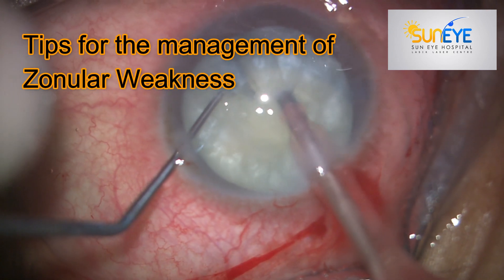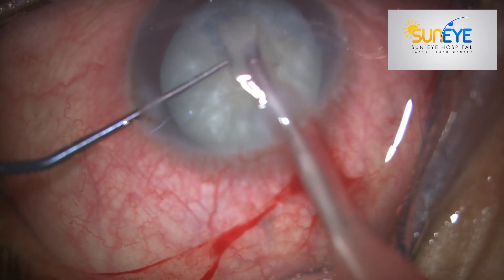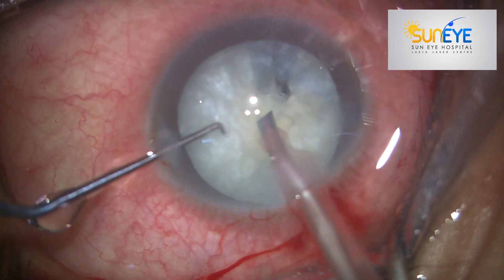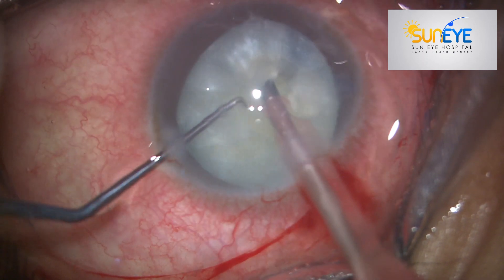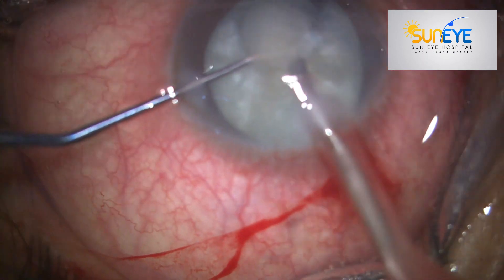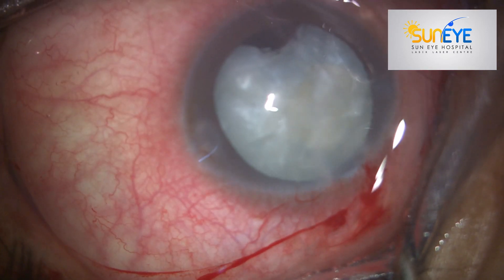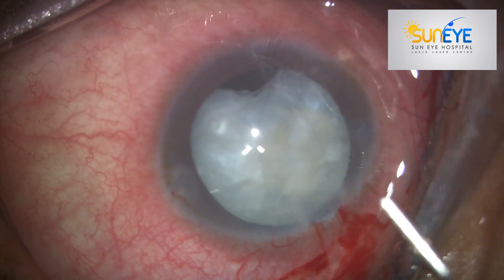Hello everyone, today I'll be showing a video on tips for the management of zonular weakness. This was an intumescent cataract and I started the nucleus fragmentation part, and suddenly I realized that there is an area of zonular weakness. You can see that the capsule is trying to curl up.